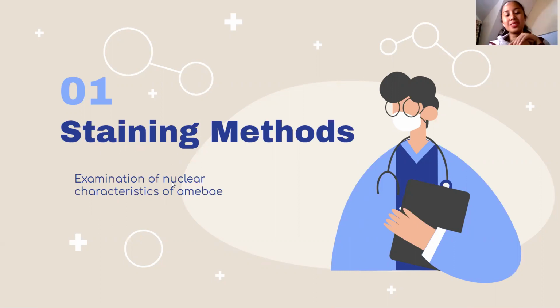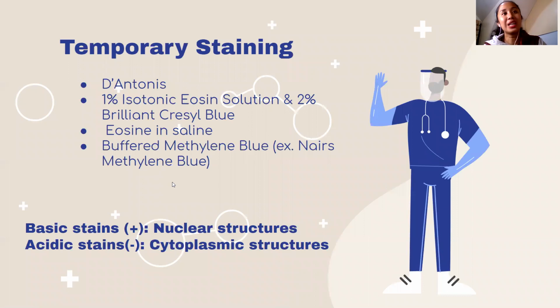Yan. So when we're detecting helminths, helminth eggs, ova, yan, we use wet preparation, wet mount preparation, concentration techniques, class, not so much staining methods, amoeba usually. So class, for temporary staining, number 1, Lugol's or the Dobell's iodine. So we stain the glycogen. So glycogen ang sagot doon. Usually, yun hina-highlight ni iodine.